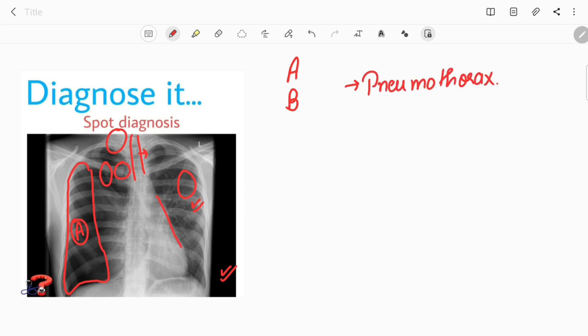Coming to the cardiac shadow, you can see there is a shifted cardiac shadow — the mediastinum is shifted towards the left. There is also a left shift of the mediastinum. The diaphragm is looking basically normal.